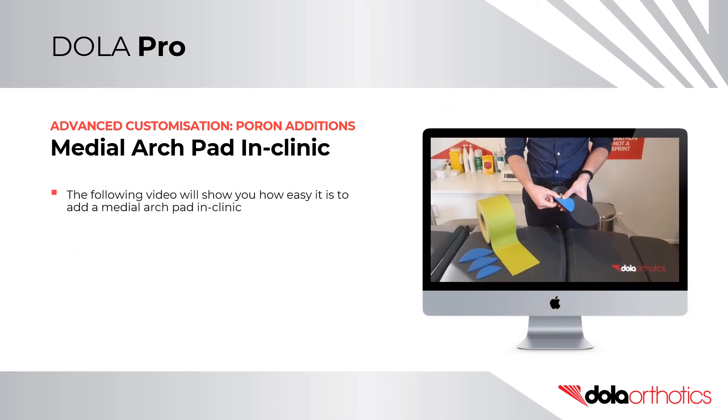Adding a medial arch pad to an orthotic is a common in-clinic modification. The following video will show how easy it is to add a medial arch pad to your orthotics in clinic.